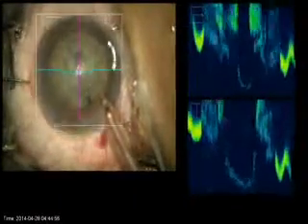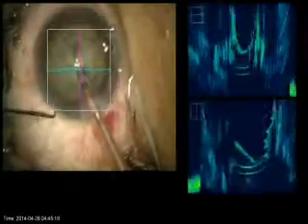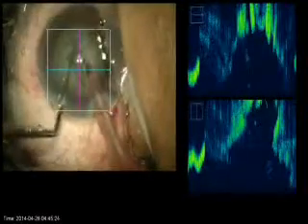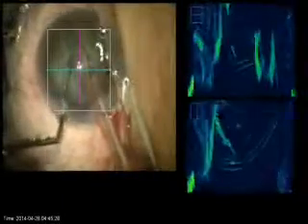Rescan 700 can help the trainee to assess the depth of the trench in real time during phacoemulsification. It can be seen on the OCT that after trenching to 80 to 90% of the depth, one can easily crack the nucleus.